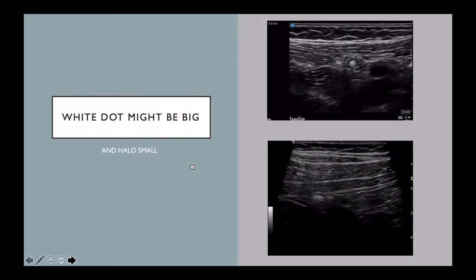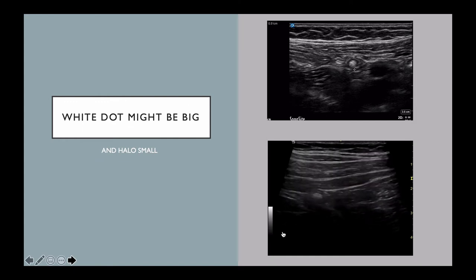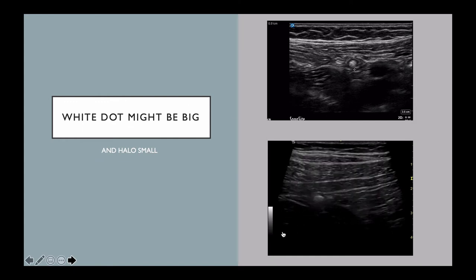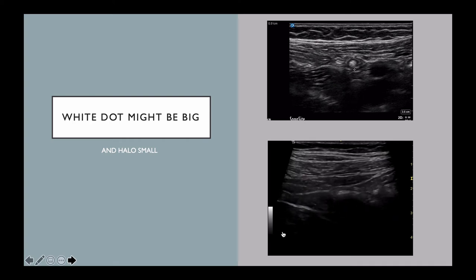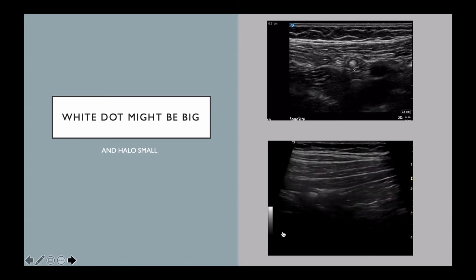At the top here, we've got another little area of faecalith or possibly gas. And if you look at the picture in the bottom, you'll see that same gas-filled appendix as we follow it along. This is not an abnormal one, by the way. And you see how the muscles above move separately to the intra-abdominal contents.